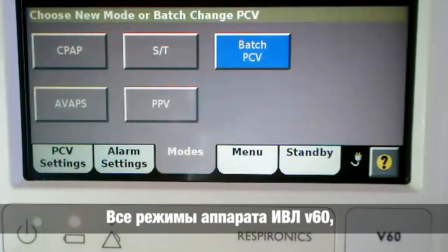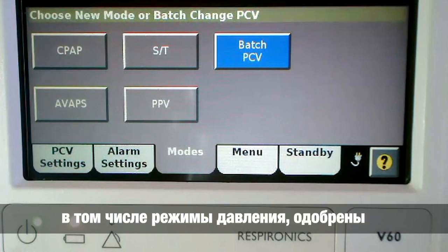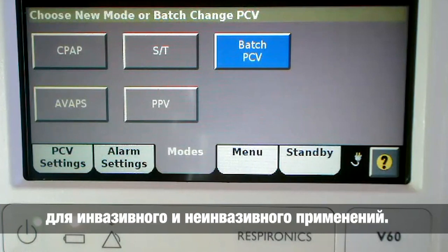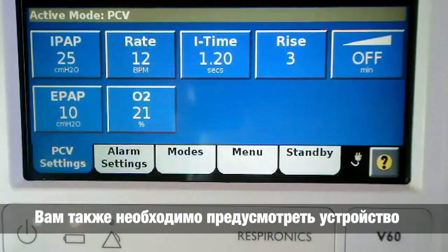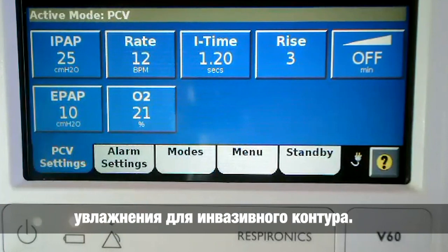All modes on the V60 Ventilator are pressure modes. All modes are approved for invasive and non-invasive use. You will also need to consider your humidification device for an invasive patient.